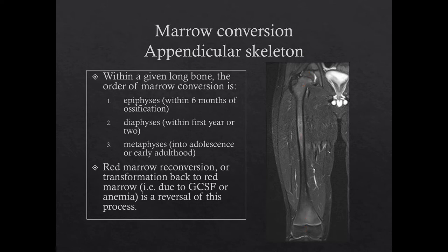Since marrow conversion in the skeleton goes from distal to proximal, the last place to convert in the femur would be in the proximal metaphyses. This also explains why some adult patients can have residual red marrow in the metaphyses, sometimes seen on routine shoulder or hip MRIs. Also note that red marrow reconversion is a reversal of this entire process.